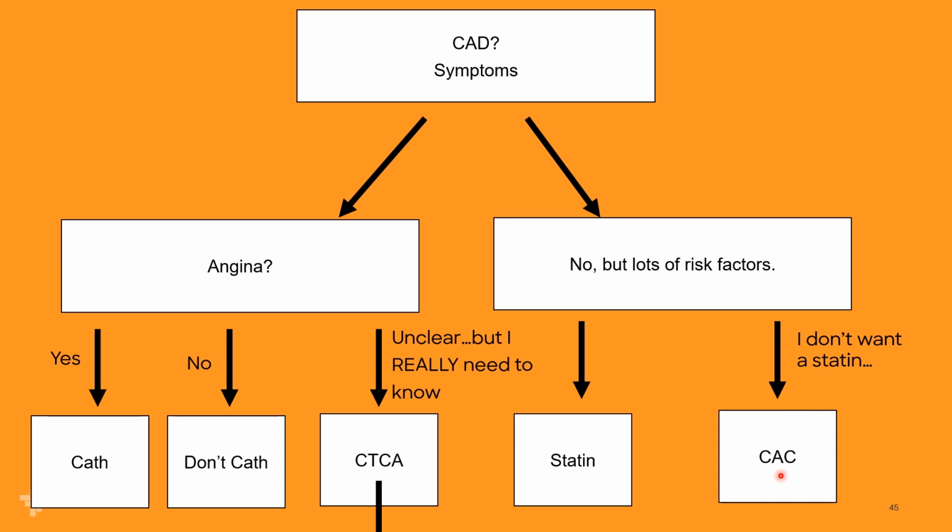What if they're having angina? So if they're really having angina, they come in and it's like an elephant sitting on their chest when they walk down the block, I don't have any problem saying, let's go to the cath lab because we don't want to miss something. But if you're not sure, or if they really don't have angina, if every time you push on their chest it hurts, well, you don't need a heart cath for that. But sometimes we're in the middle, and I really need to know what the next step is. And so we'll do CTs.